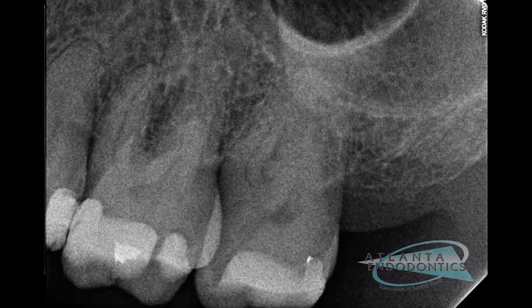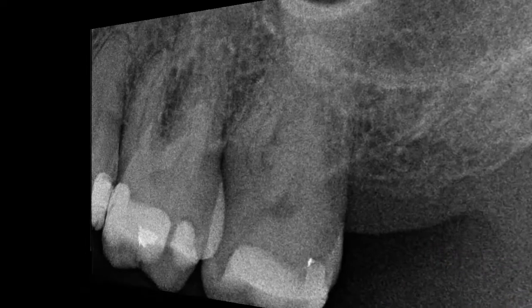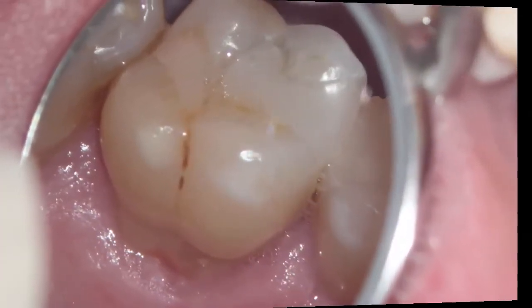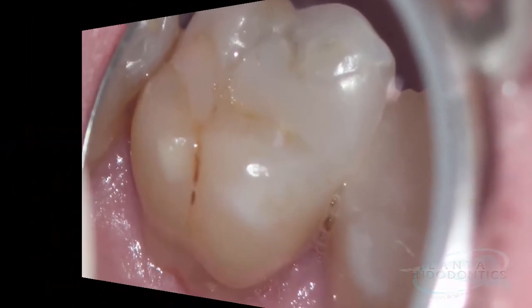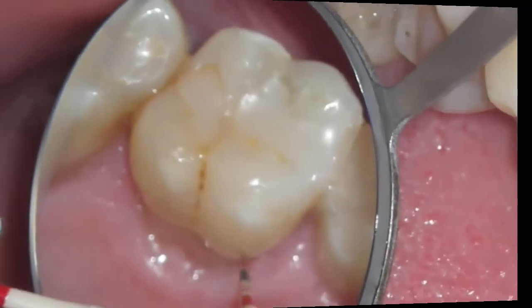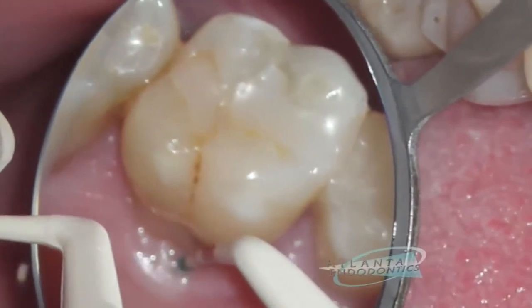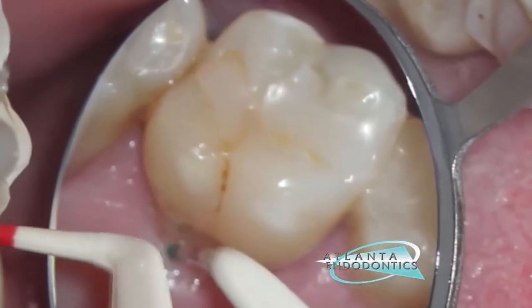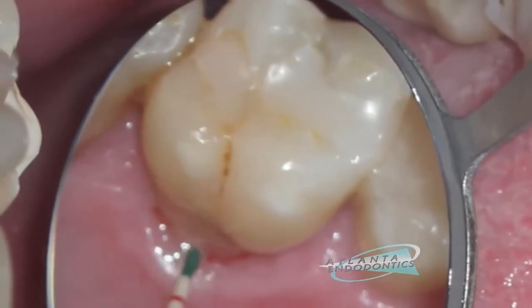This 46-year-old male with a history of 13 years of orthodontic tooth movement presented for evaluation of pain in the upper left quadrant. In this situation, probing depths were within normal limits, but a resorption defect was suspected.